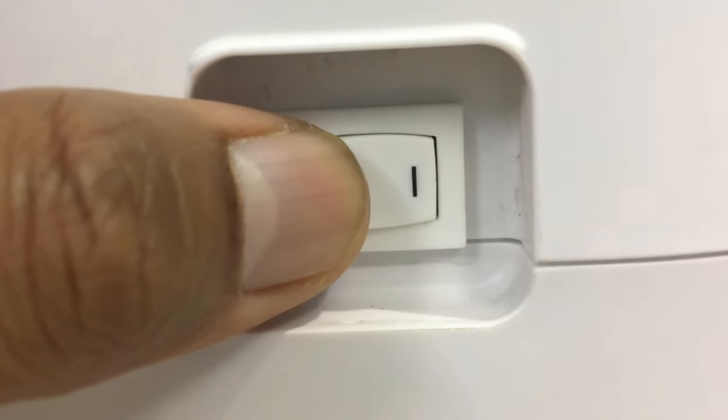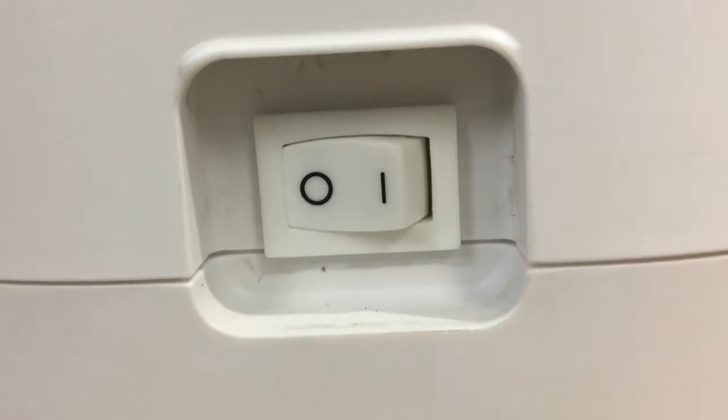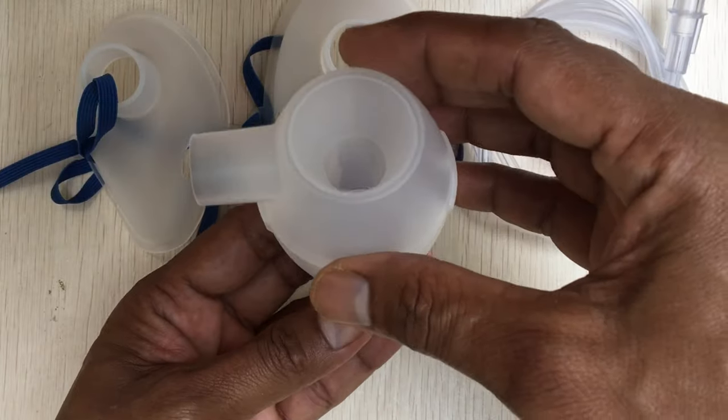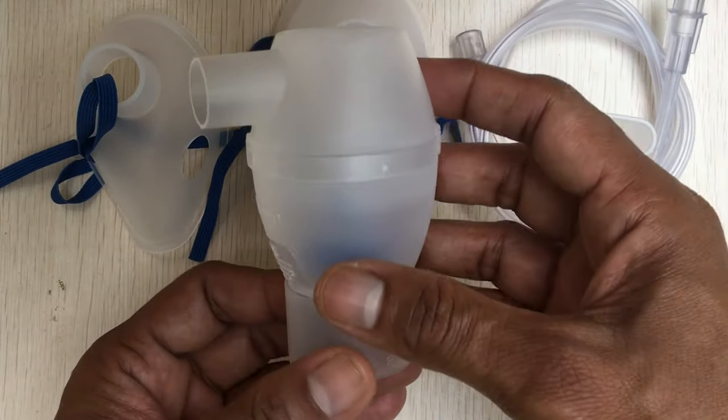Once the treatment is complete, turn the power off. Remove the tubing from the compressor and the nebulizer kit. Clean all parts for next use and store in a safe place.